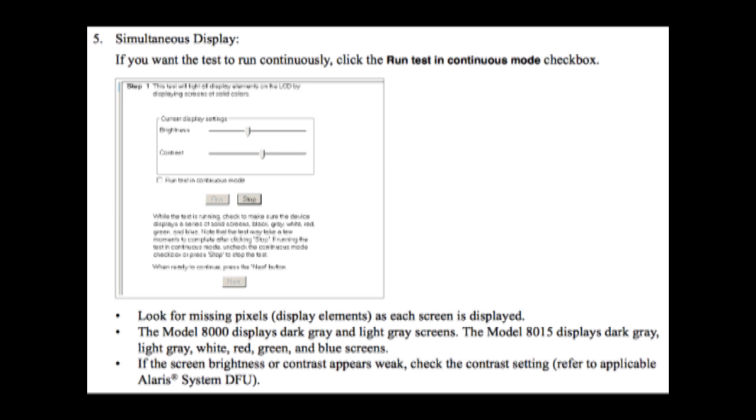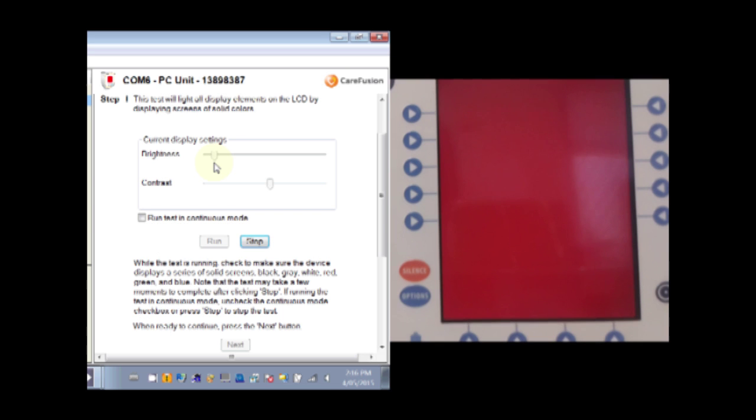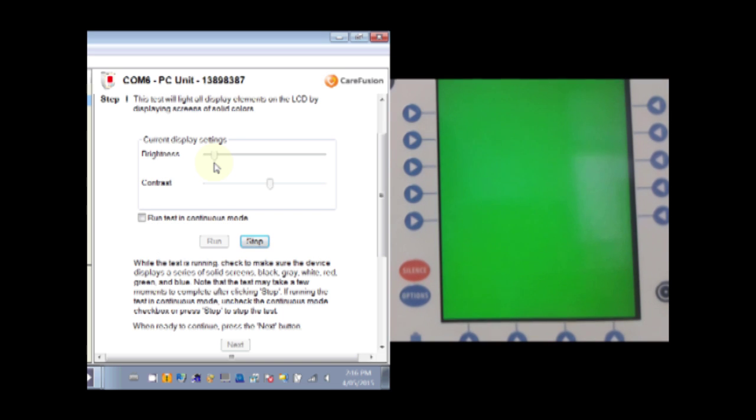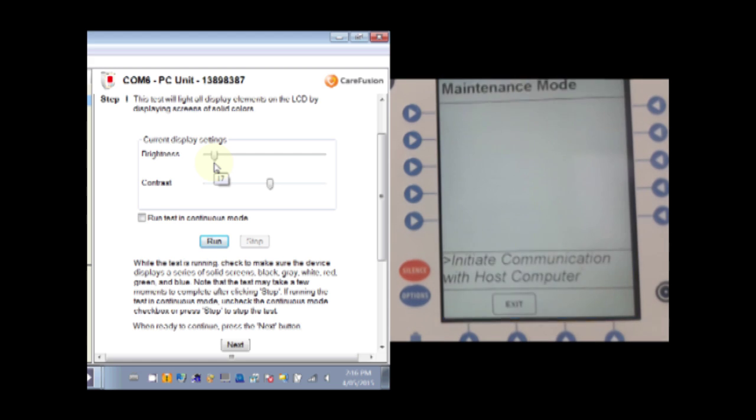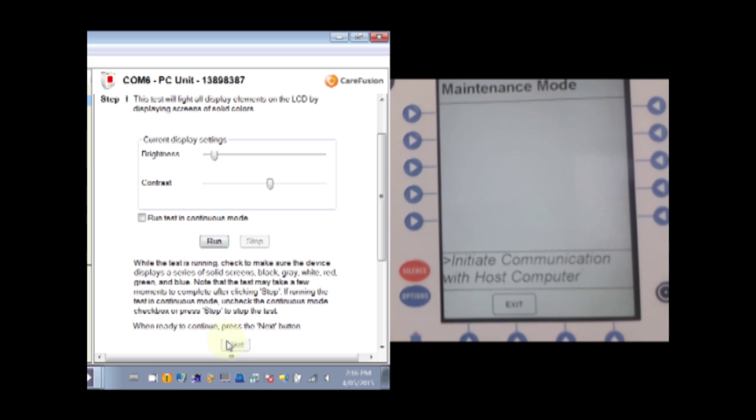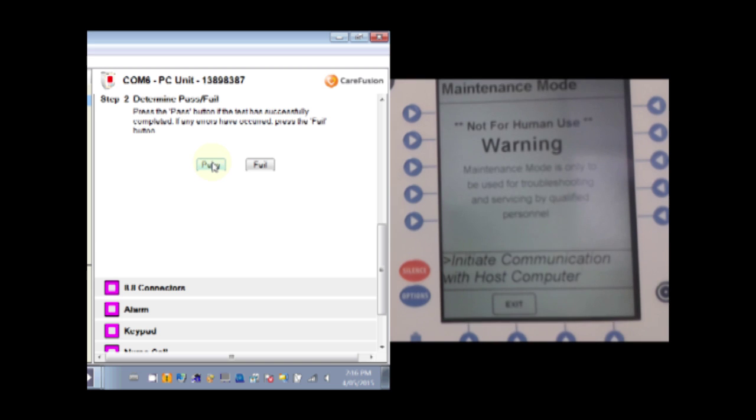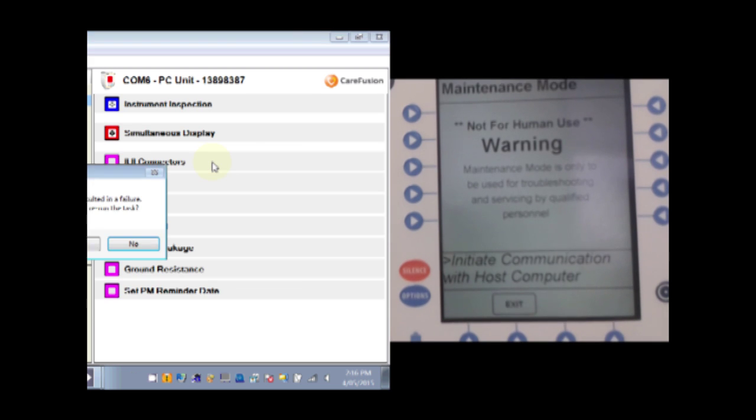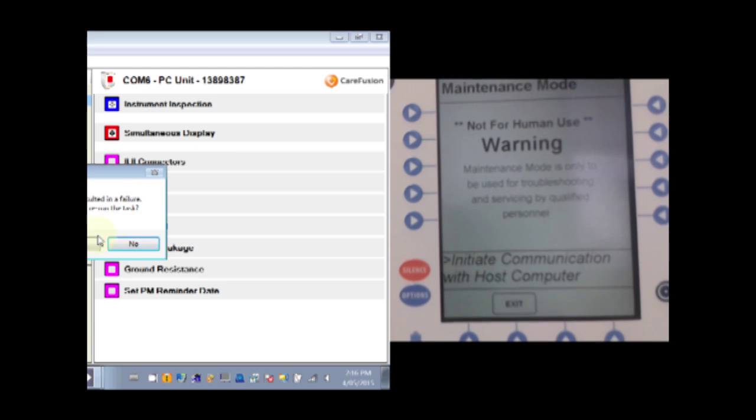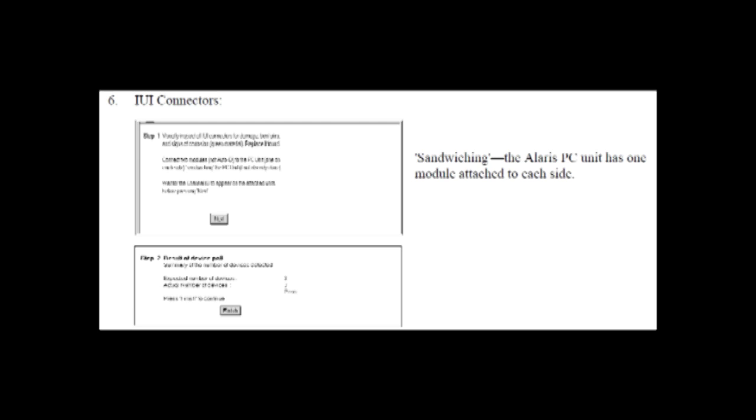First the Simultaneous Display. Here we are just testing that the segments and the colours are OK on the display. You can see random errors occasionally pop up.